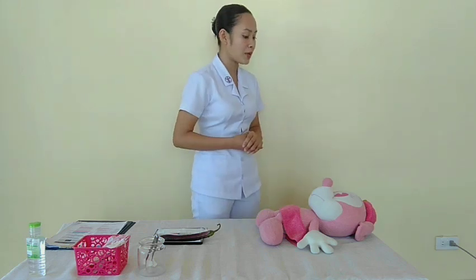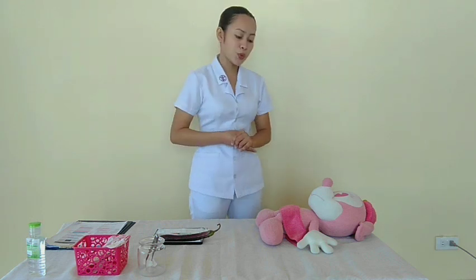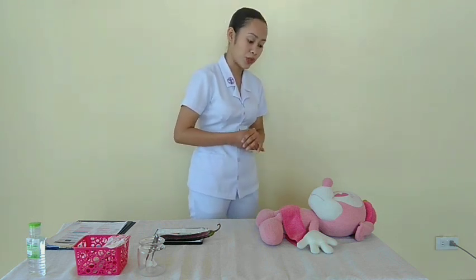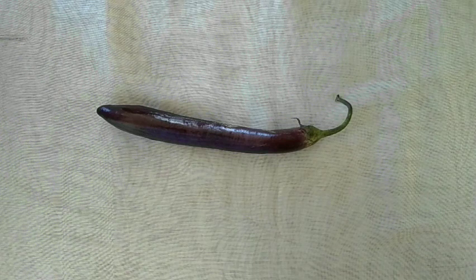So as you can observe, ma'am, I'm now providing your privacy by closing the door and the curtains for your dignity, so no one from outside will disturb us during the procedure. For the subcutaneous injection, we need to select a site that is free from lesion, tenderness, and swelling, and we'll have to apply clean gloves.